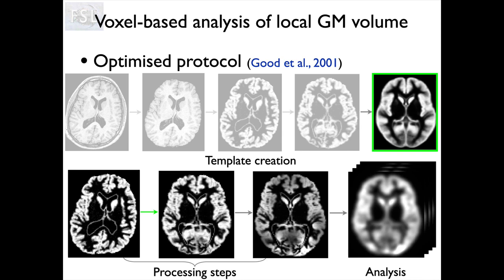And we do that because it gives us statistical benefits. It compensates partly for a little bit of location error in the registration, but I think the main benefit that we derive from it is really the statistical power that we get by doing some smoothing. Because if you're familiar with how statistics works, smoothing is always beneficial in terms of helping to suppress noise, as long as you don't smooth your signal away.